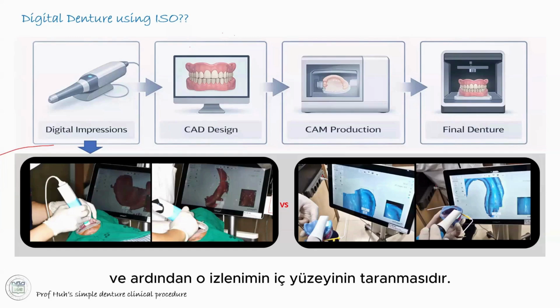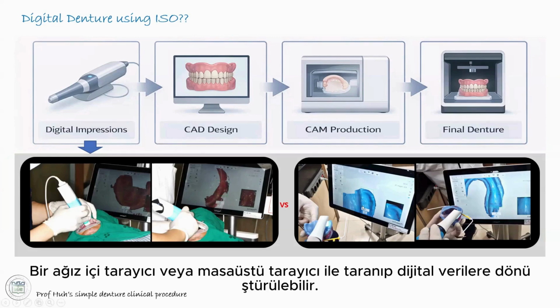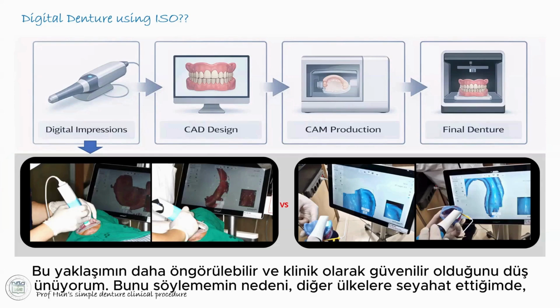And then the inner surface, can you see that? Anyway, the inner surface of that impression can be scanned with an intraoral scanner or desktop scanner and converted into digital data. So I believe this approach is more predictable and clinically reliable.